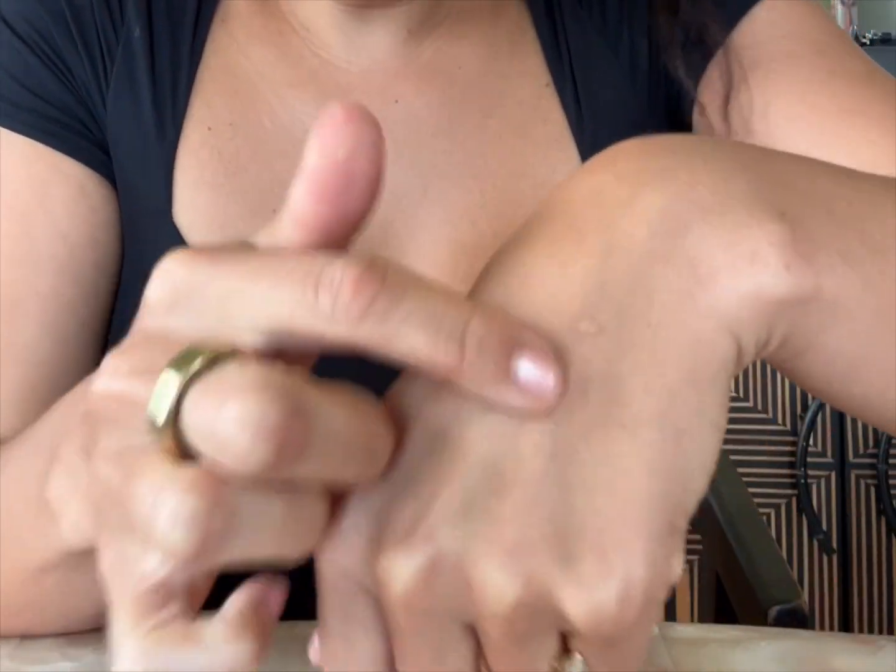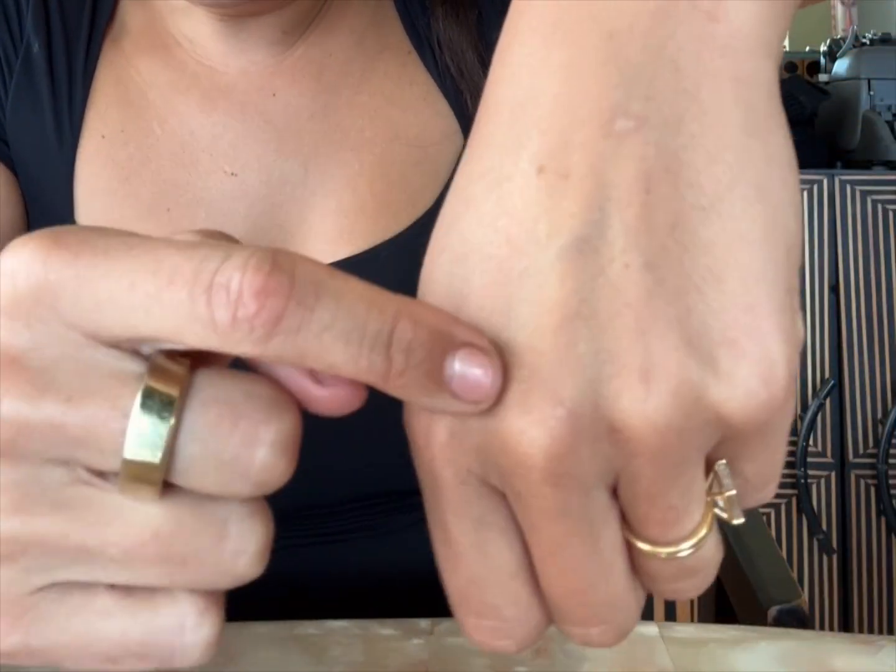When you're choosing an IV size between 20, 18, or 22, a lot of people in the comments say you can put a 16 or 18 in that. Although yes you can, because anything you put a tourniquet on will look massive, when you're choosing what catheter to put in, you're choosing a size based on what the vein looks like when you remove those tourniquets.